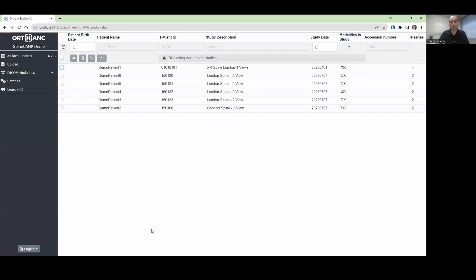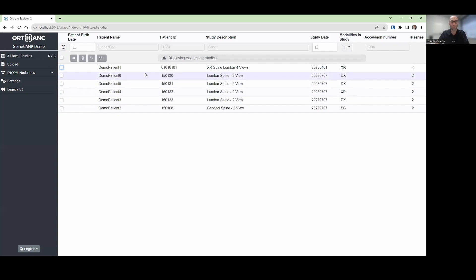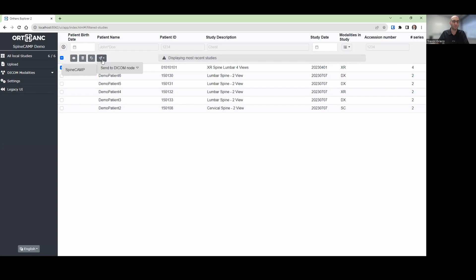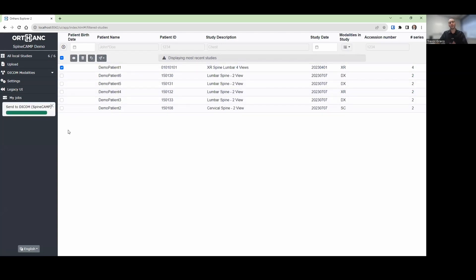I have a demo PACS environment here. It's been preloaded with a number of demo patients, and we'll just work with this first patient here. It's a lumbar spine four-view x-ray study, and to send this to SpineCamp, you will simply select the patient and use your DICOM send tool to send to SpineCamp. It's that simple.